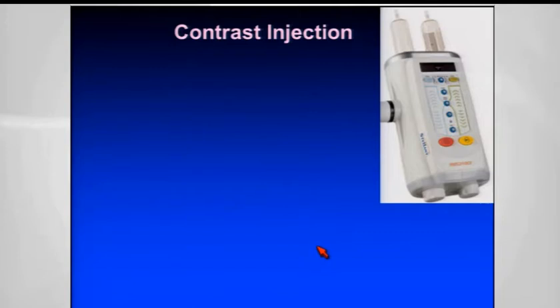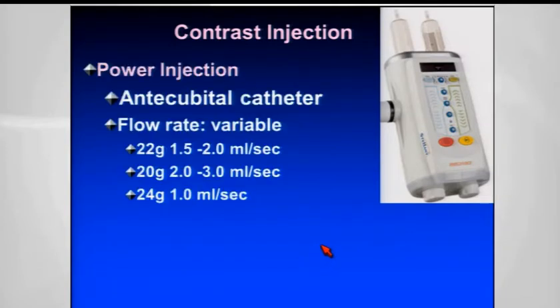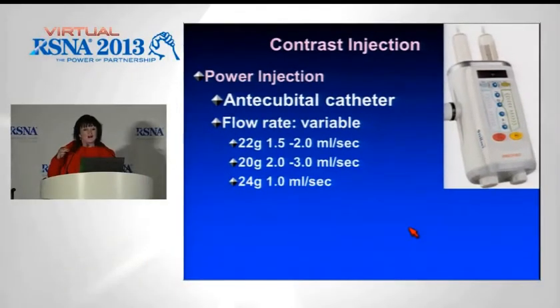Contrast injection and injection rates are very important, and we're very fond of power injectors. We're fond of them because we think they're quite safe, because they do not allow you to go above a specific pressure. And if the pressure rises, there's a specific measurement of pounds per square inch, the pump will stop. And we'll show you in a moment some of the data from Sue Cast. She's looked at the data back in the 90s and shown that power injectors are just as safe as hand injection, and we've had very similar data from our group.